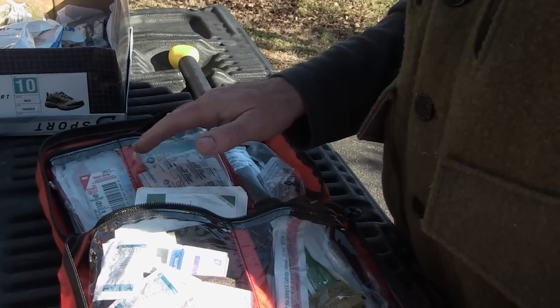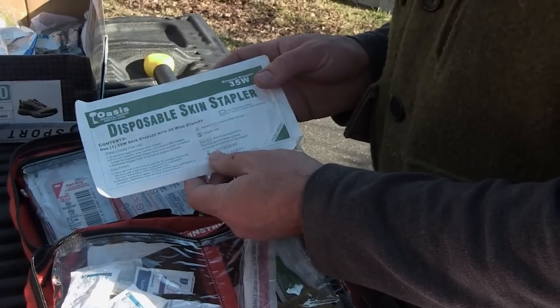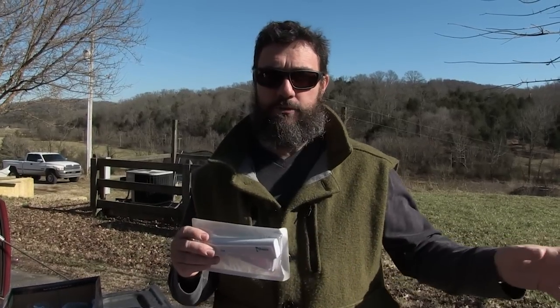Another option instead of a SteriStrip or a suture needle is a disposable skin stapler, which I have in this kit. Honestly, this is the kind of thing you're more likely to use on somebody else.